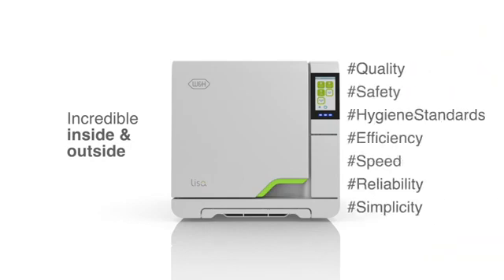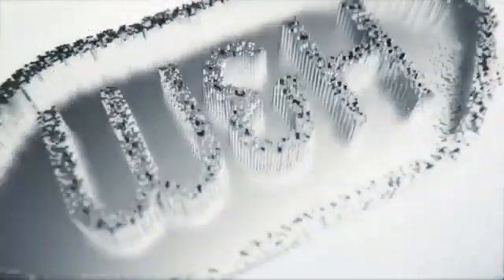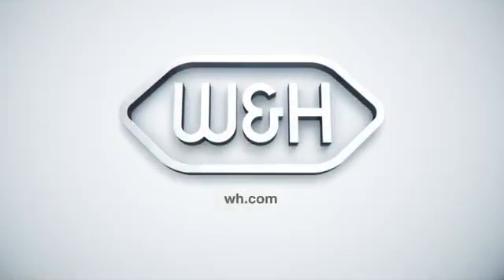More information as well as instructional videos can be found on the W&H website and video channel. W&H. People have priority.